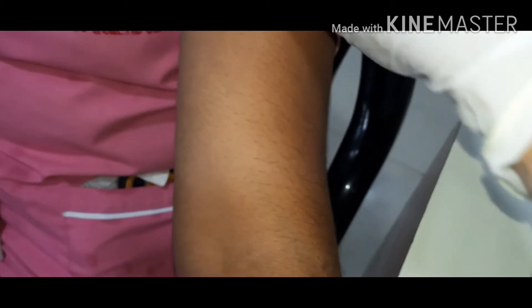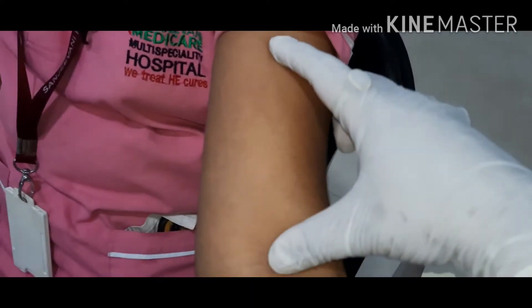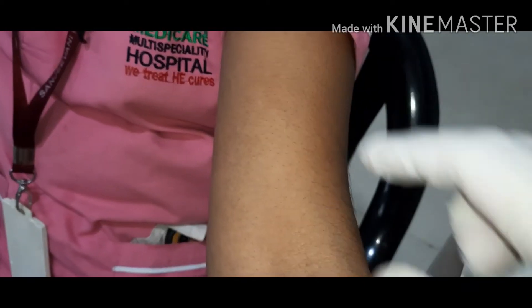To measure blood pressure, the patient should be in a sitting posture and the blood pressure instrument should be at the level of the heart.